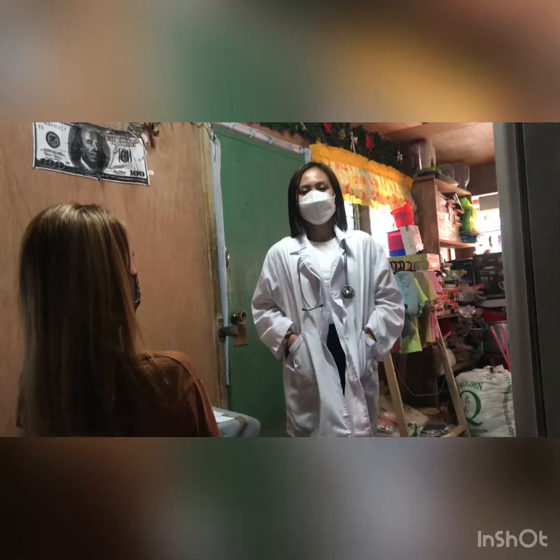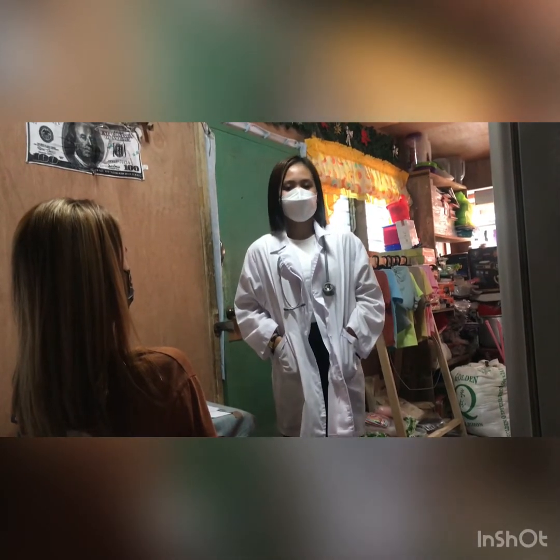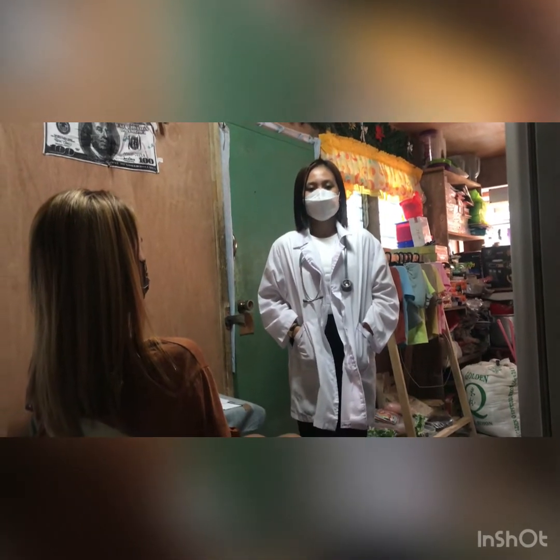And the pulse rate, it is the wave of blood that is created by contractions of the left ventricle of the heart that is regulated by the autonomic nervous system. So today, I am going to demonstrate assessing the temperature.